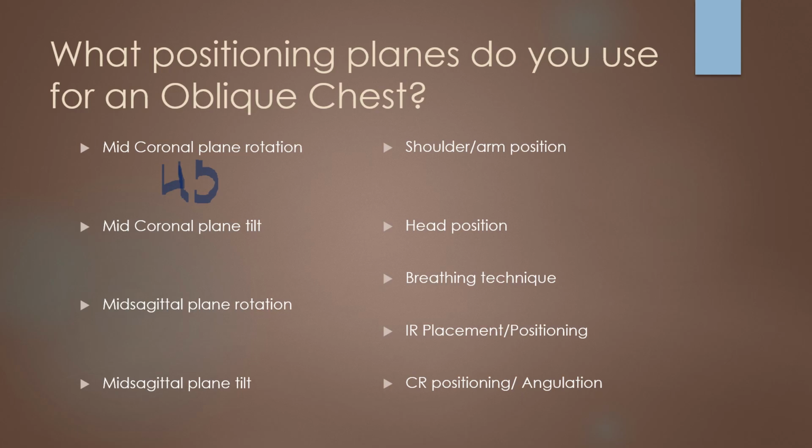Shoulder and arm positions for this, you're going to have to elevate them out of the chest and lung field. Head position, the chin needs to be elevated. Breathing technique, we're going to utilize that second inspiration breath hold.